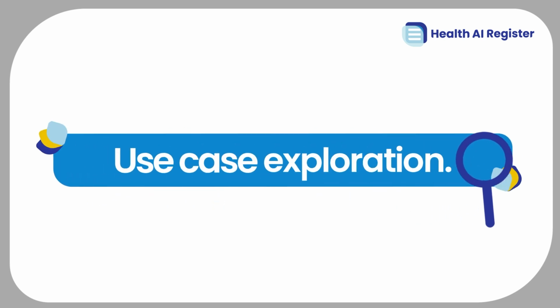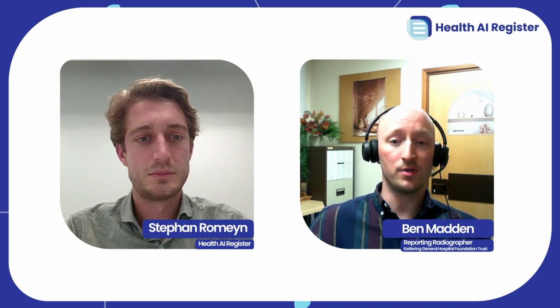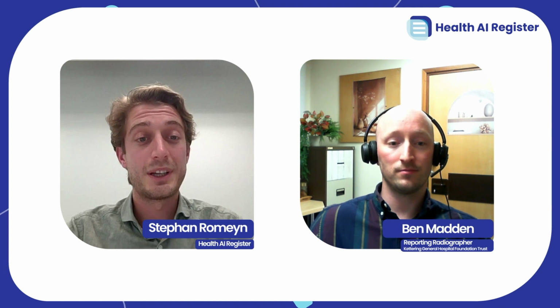So to get started, why did you actually start exploring AI applications for the fracture detection use case? So we wanted to improve ED X-ray trauma turnaround times, and we also wanted to look at reducing ED missed fracture rates. We did look at hot reporting, but it wasn't financially viable. So this is when we started looking at AI products that could help us out. So it was both for the turnaround times and reducing the missed findings. Yeah, although technically it wouldn't reduce turnaround times because it wouldn't be seen as an official report, but at least it was something ED could look at and start managing if we deemed it to be accurate enough.